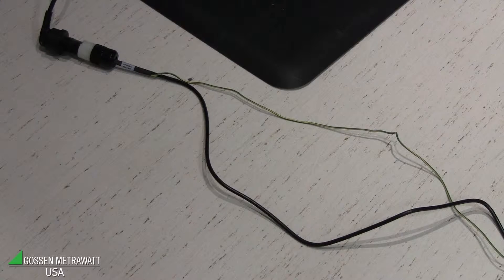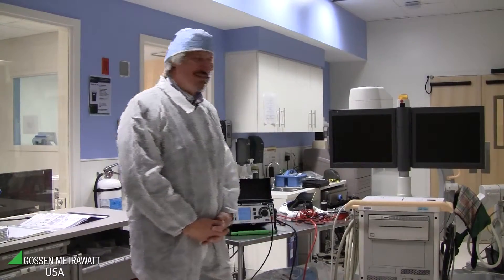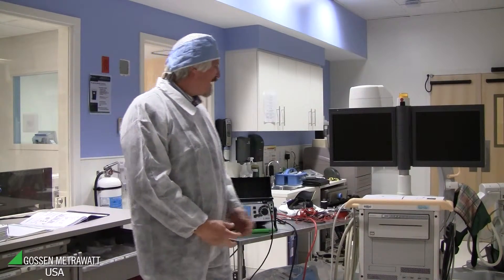For this patient leakage and touch current measurement we use a very special cable to get accurate measurements. This cable has a black cable and a green and yellow one, so the protective earth connector is separate to connect on the reference point of the system. This time we do touch current measurement on mobile X-ray equipment.